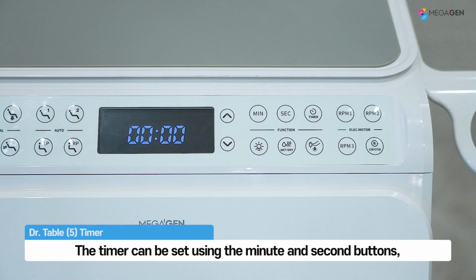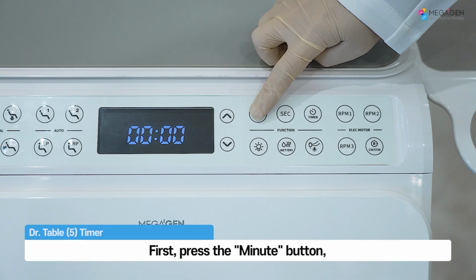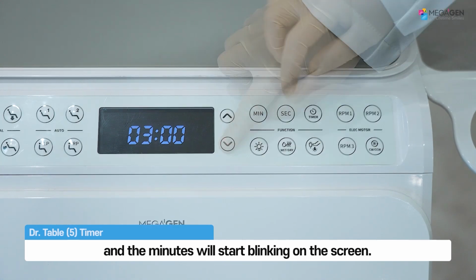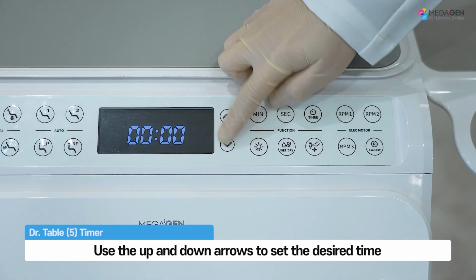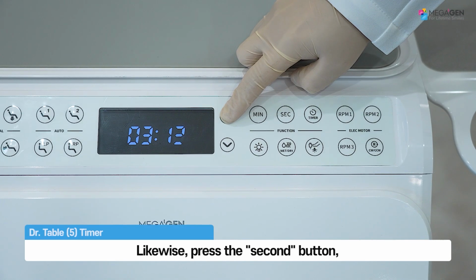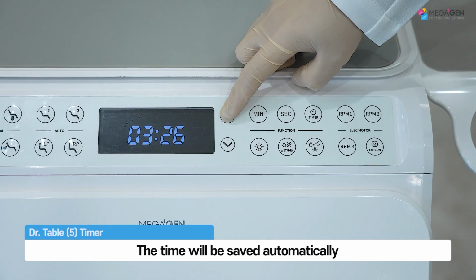The timer can be set using the minute and second buttons, which is useful for taking impressions. First, press the minute button, and the minutes will start blinking on the screen. Use the up and down arrows to set the desired time. Likewise, press the second button and use the arrows to set the time in seconds. The time will be saved automatically.